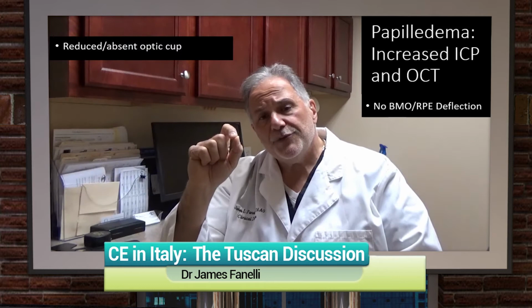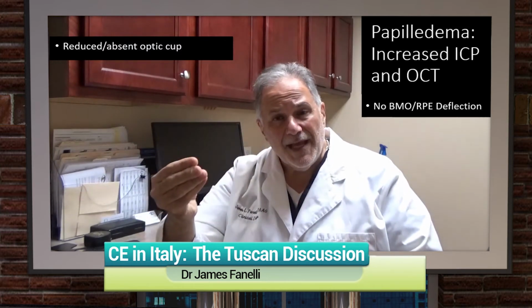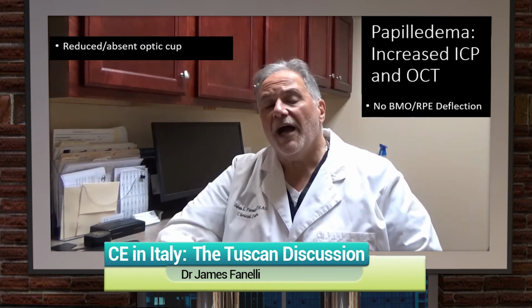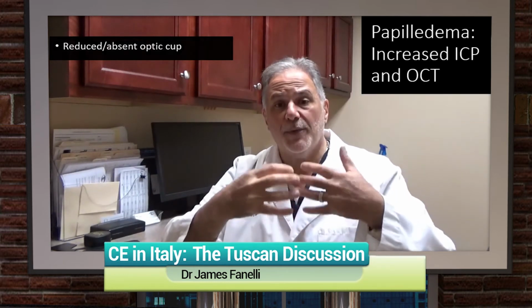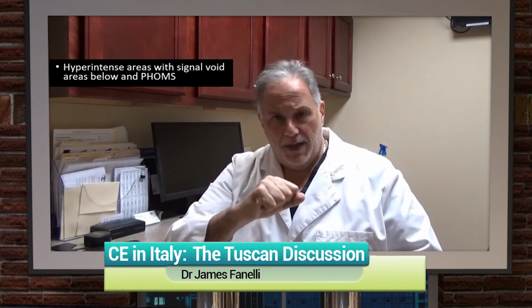And in disc drusen, especially if they are calcified, this makes sense, we're going to see hyperintense imaging on OCT where there is calcification. And beneath those areas of calcification, we're going to see areas of signal hypointensity. So in optic disc drusen, there are areas of hyperintensity and hypointensity.